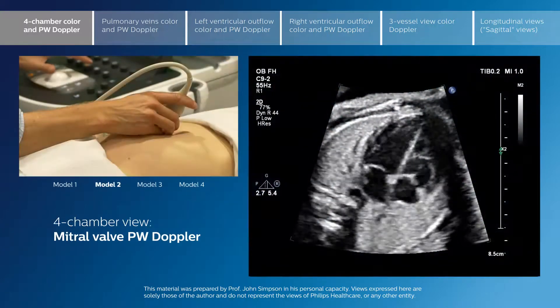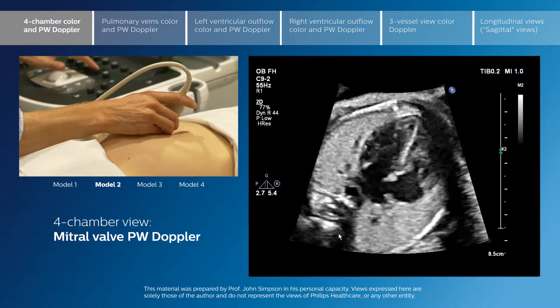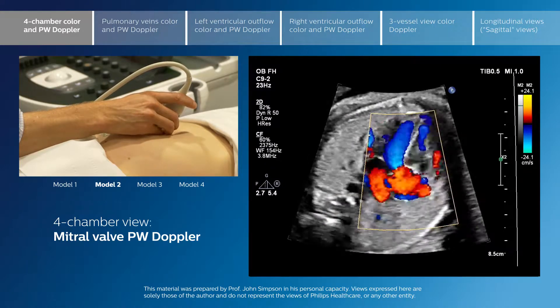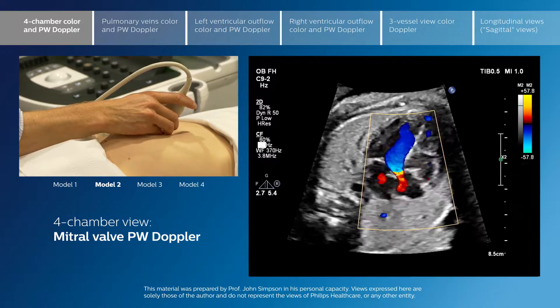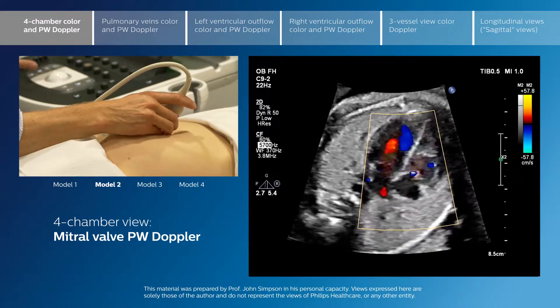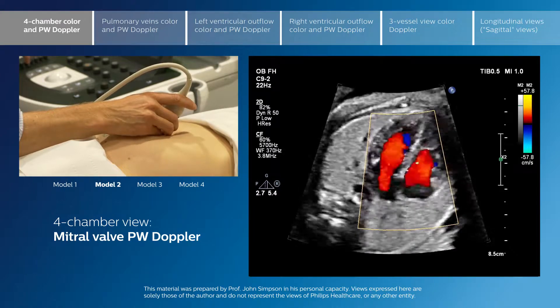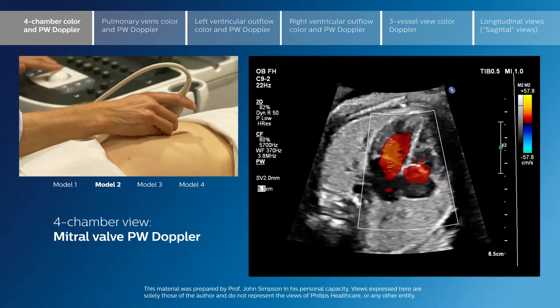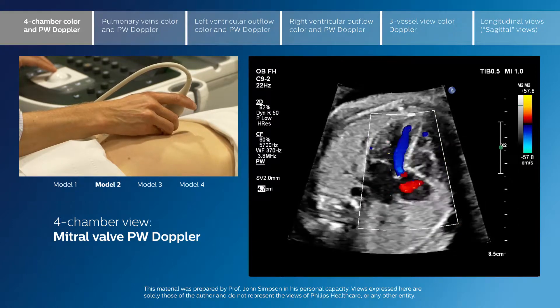We'll now apply standard colour and increase the colour scale. The colour scale should be adjusted depending on whether we're looking at pulmonary veins or at AV valve inflow. Here the colour scale is around 60, which is appropriate when interrogating mitral valve inflow.